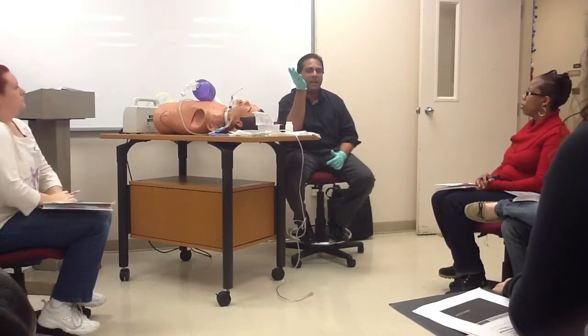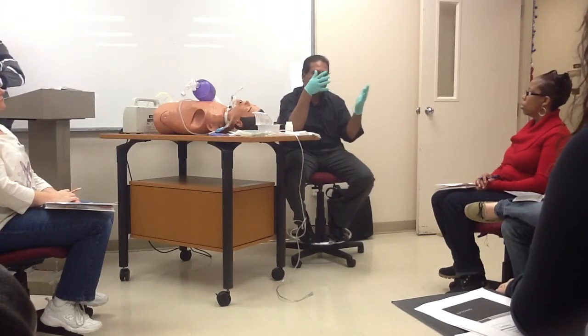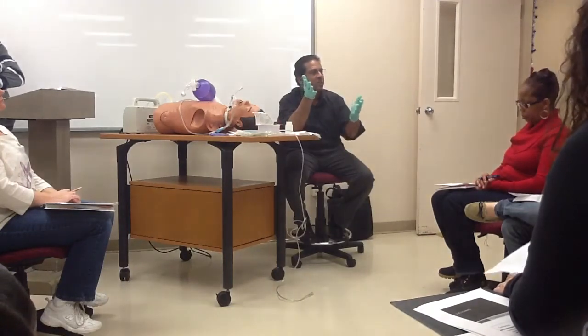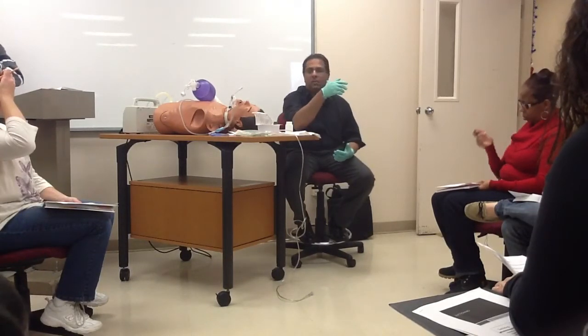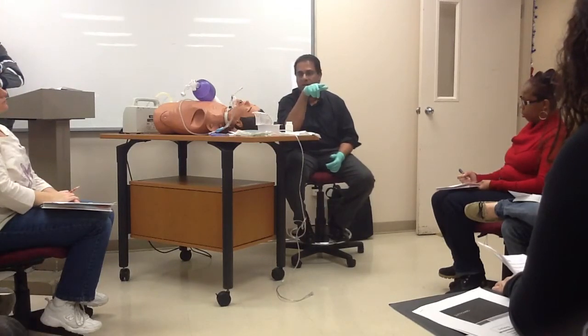10 is actually better. When you start suctioning, if you're not getting a lot of secretions with the 10, what do you need to do then? Then you go to the 12. If you have thick secretions and you can't get the stuff out with the 10, you go to the next step, which is 12. This stuff is on your NBRT exam, so make sure you understand this, okay?